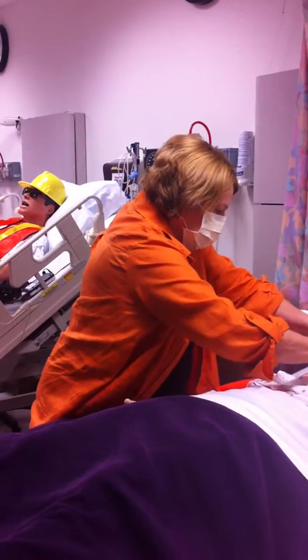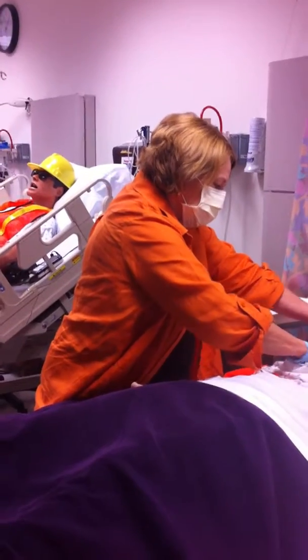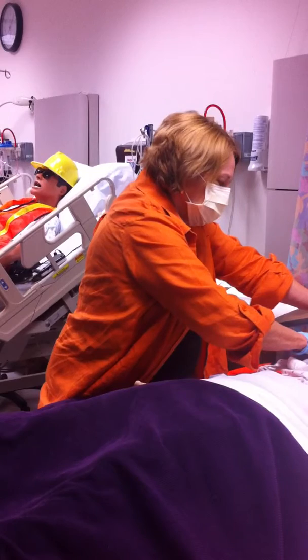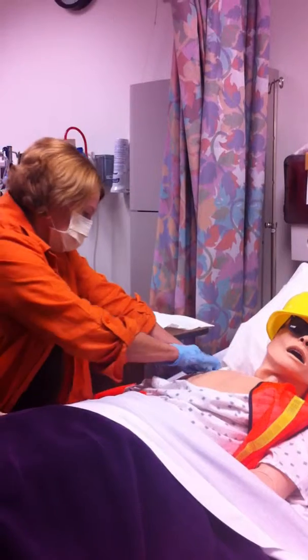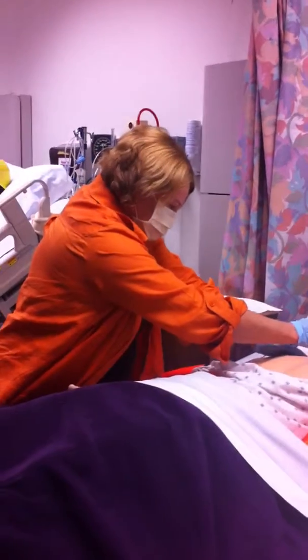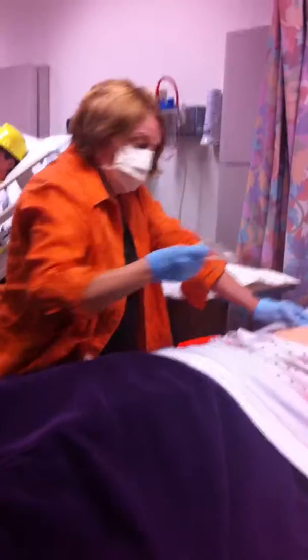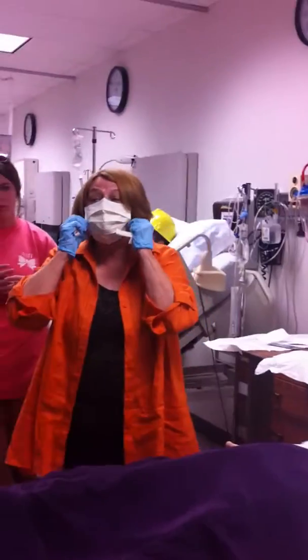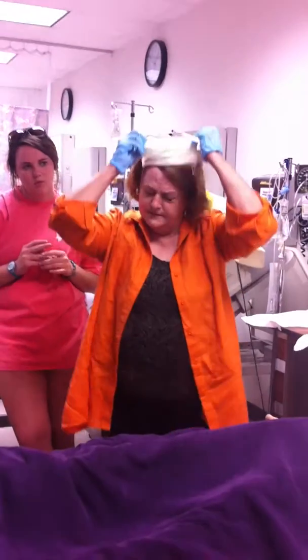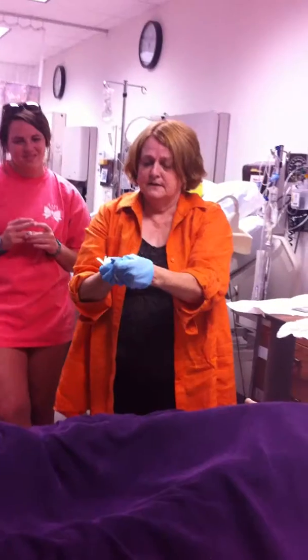Okay. At this point, I have completed my sterile procedure. You need to always know when sterile is done, because that will tell you when you can take off these gloves and mask. Okay? You see that sterile is finished at this point. So I'm going to take my mask off because it makes me have hot flashes. It does. And my gloves.